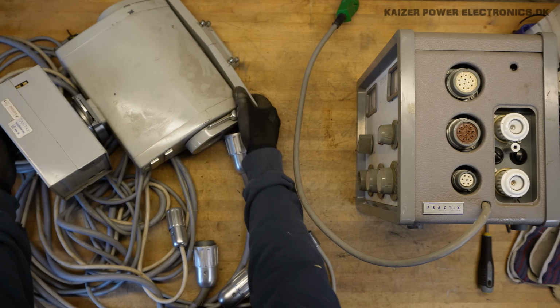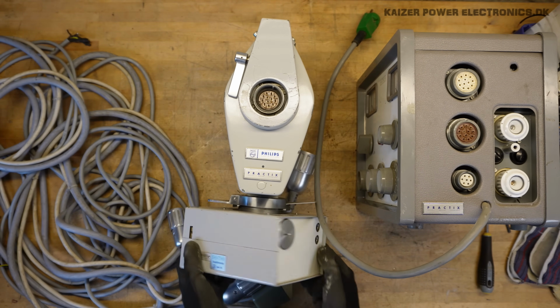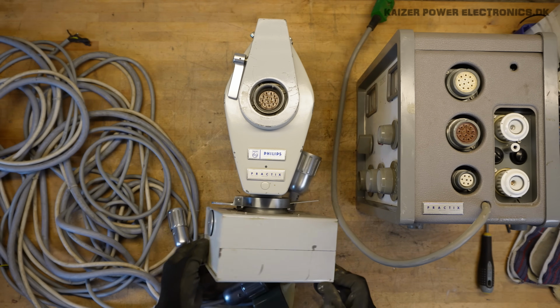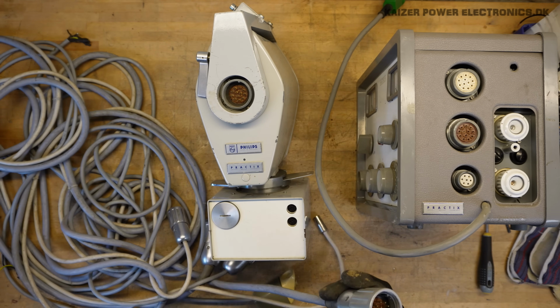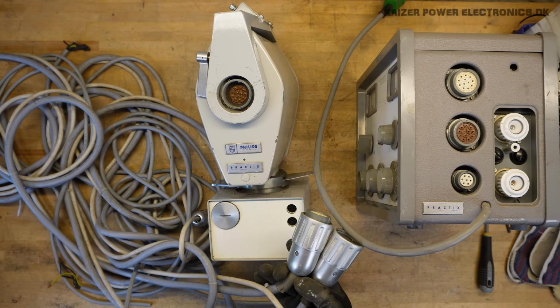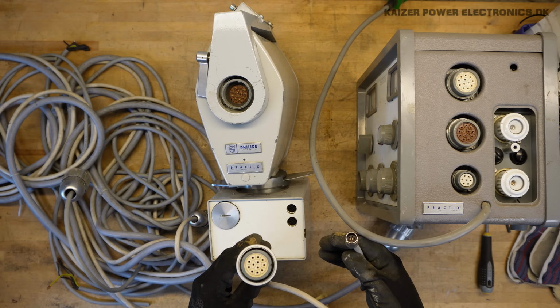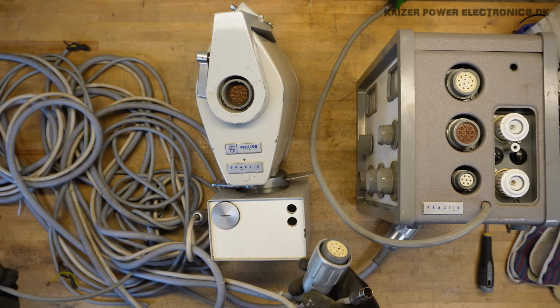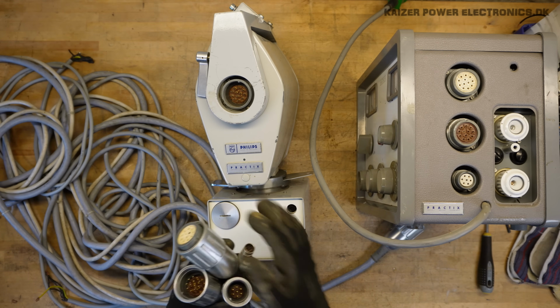Now if we take a look at the X-ray head, we can see we have a brown plug here and we have two smaller plugs here, but there's not really any white plugs anywhere. And from the cable set here, there is a white set along with this one. This is a pretty thick cable. Okay. Makes sense now.